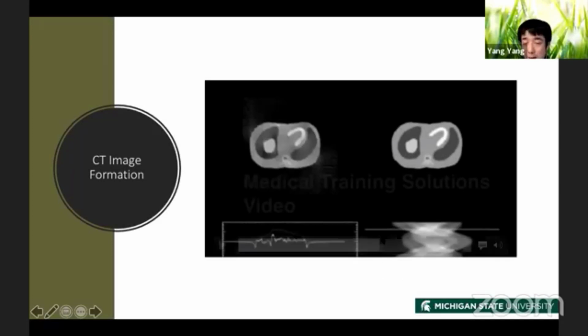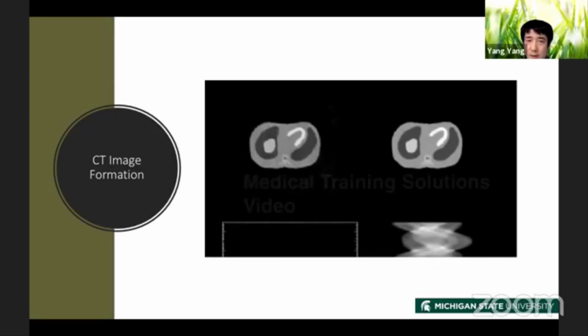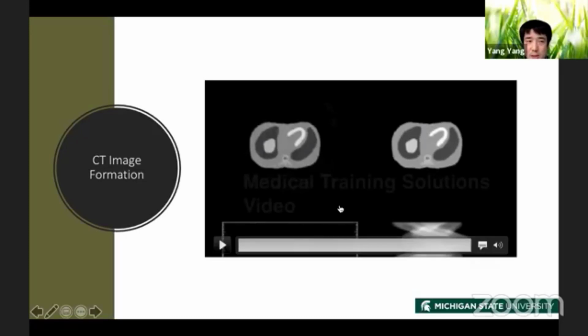Now the idea is we take the data slice by slice, and you see that this horizontal line indicates we are using the data from this slice. And we apply the algorithm to get some information about the image, and we add that information to the reconstructed image here. By doing this slice by slice, we get more and more details about the original image until, after we run out of all the data, we have successfully reconstructed the image.